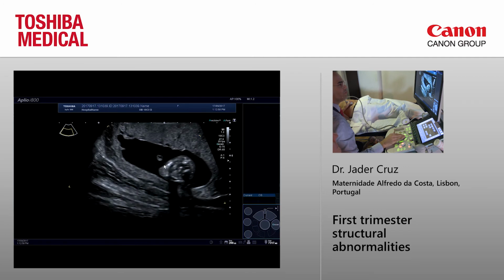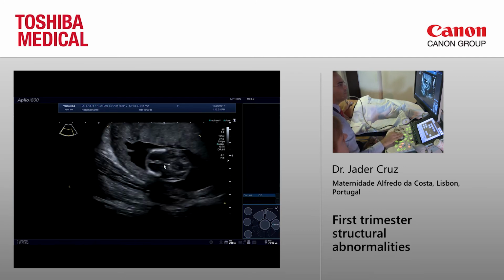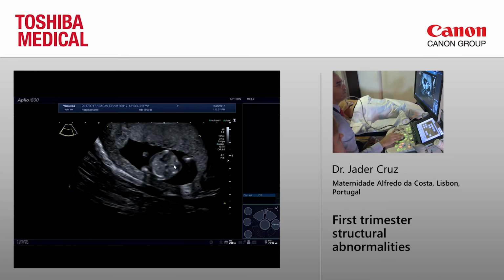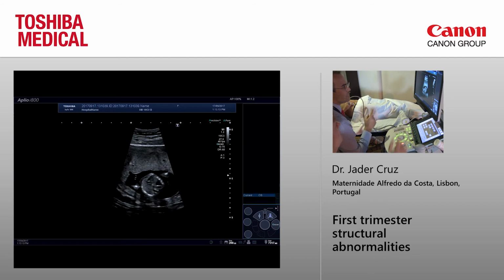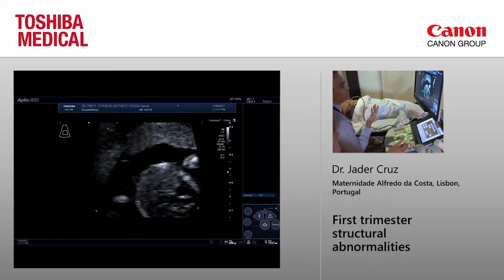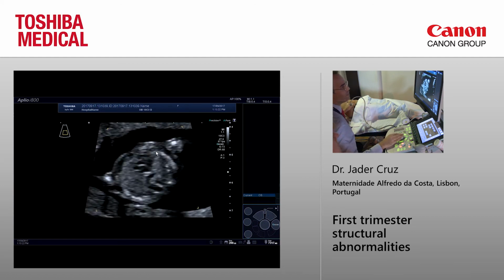Yeah, so we move that, and we come back there later if the baby truly helps. Then we go there to the thorax. You see lungs. You see the heart. We can move to the heart now. The heart is the only thing that makes me change everything, because if the heart is in the good position, you cannot actually lose the chance of looking at it. And then we see there everything that we should see.